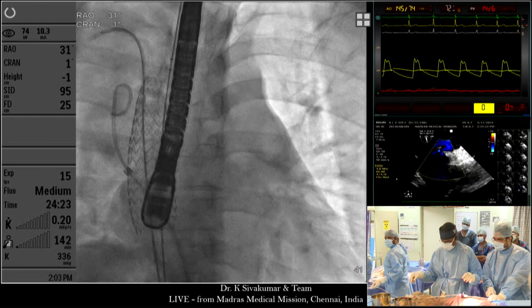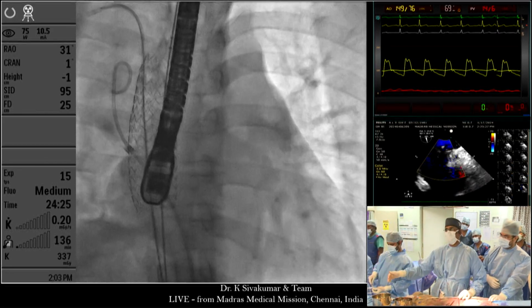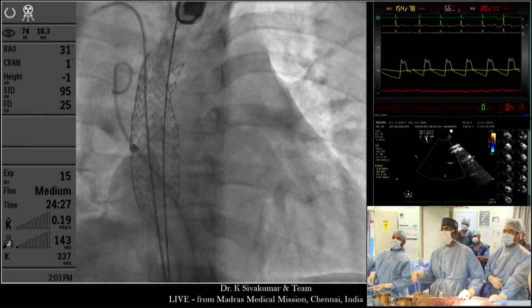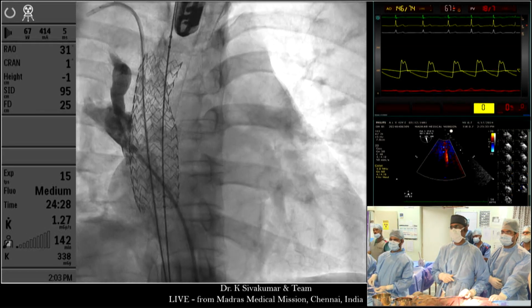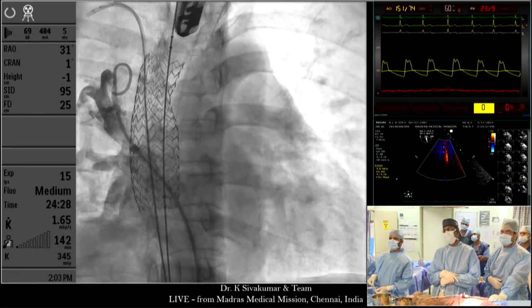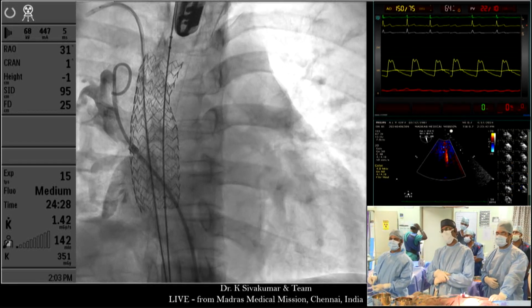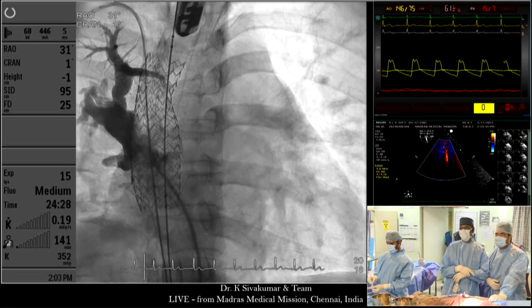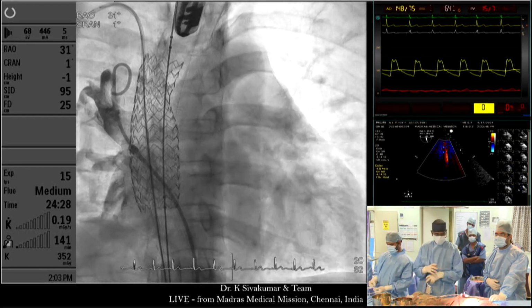Connected. You can elevate the TE probe up. Pull up the TE probe. Ready for injection. Yeah. So this is the upper pulmonary vein draining. This is possibly some amount of restrictive LV physiology. I am going to give you pressure transducers also. Filling only the left atrium.